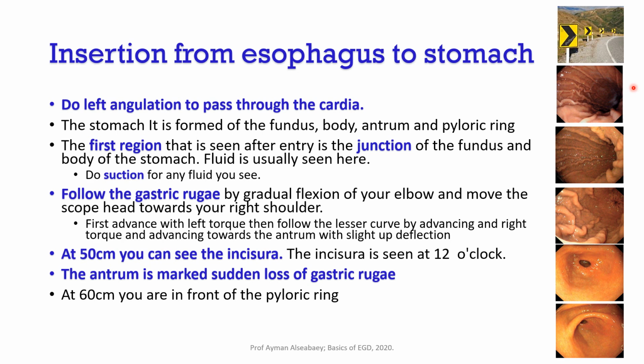How to turn to the right? Don't tell me that you will use the right-left wheel. This is wrong. What to do? Remember, when I reached the end of the esophagus, I had full extension of my elbow. So I will push the endoscope gently with gradual flexion of my elbow to the neutral position again.